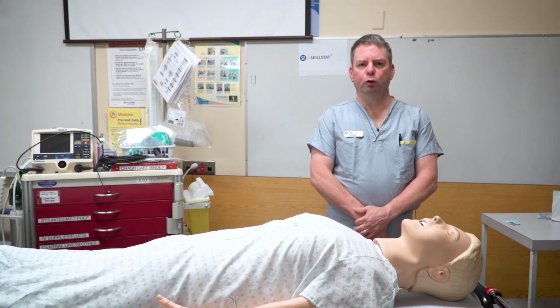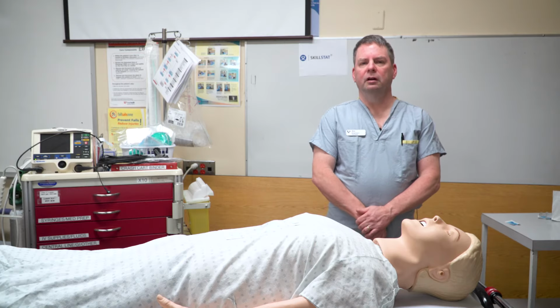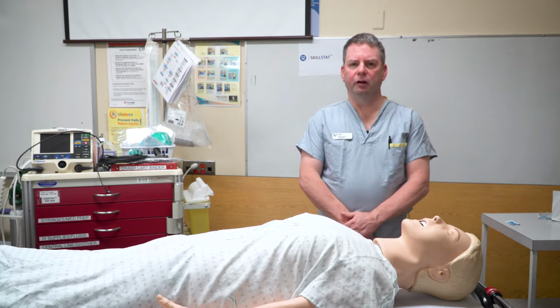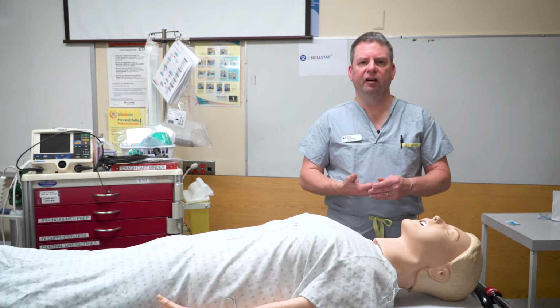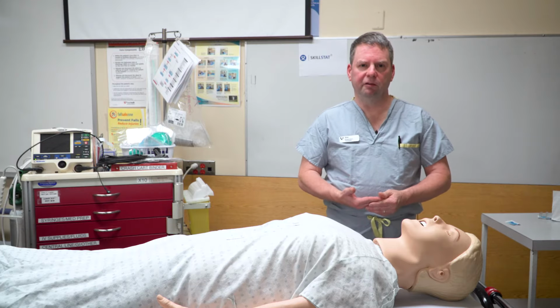So what can happen is if you put it in incorrectly or you force it in, you can cause a nosebleed. Be careful, particularly in people that have consumed large amounts of alcohol. A lot of times their bleeding factors make them more at risk for nasopharyngeal bleeds. Particularly if you've done a blood sugar on the patient and you find that they bleed very heavily from that finger poke, those would be people that you'd be really cautious about using a nasopharyngeal airway in.